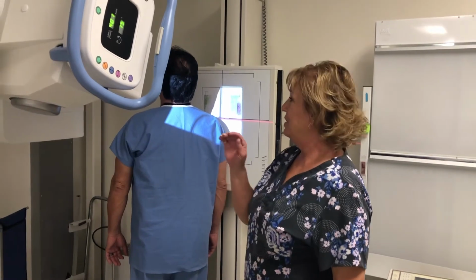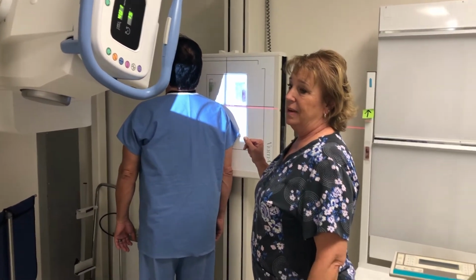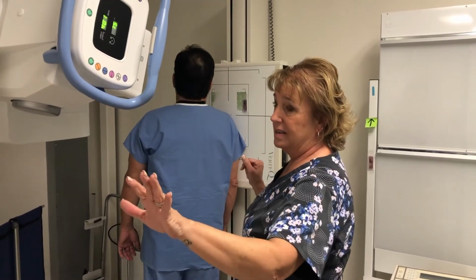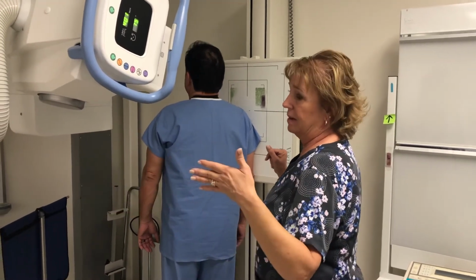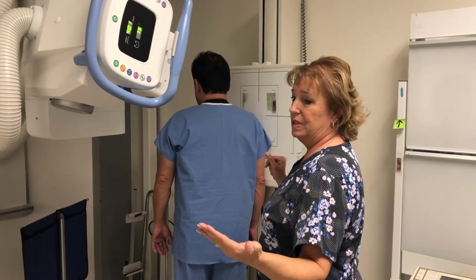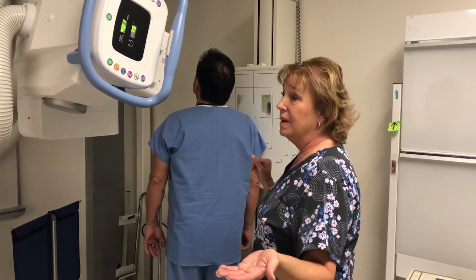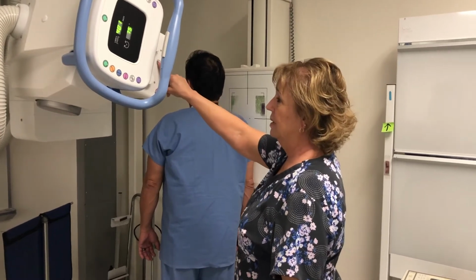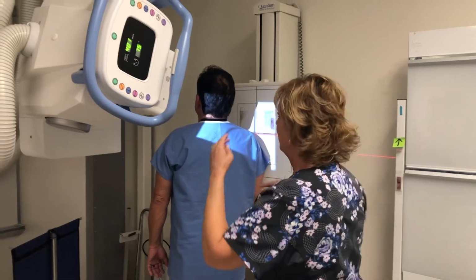All right, I'm going to demonstrate anterior obliques first. Some clinical sites are going to keep this at 72 inches. I think the book recommends that you come into 40. Anytime you're out at 72 inches, there has to be a good reason for that other than it just being convenient for you. 40 inches is less dose to the patient, because you have to use more mAs at 72 inches than you do at 40.